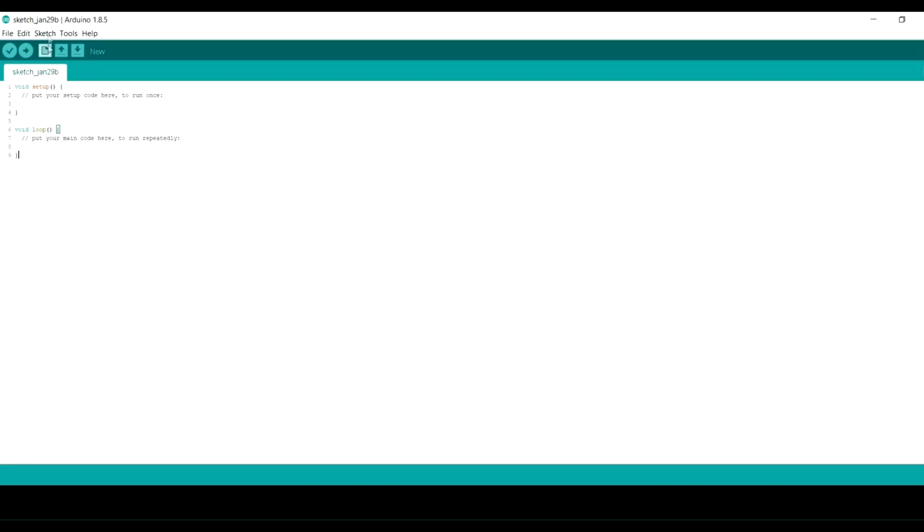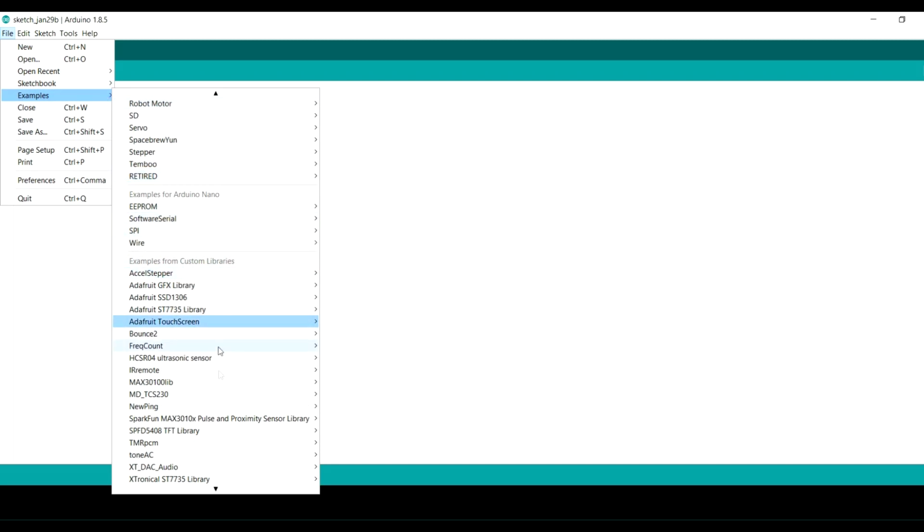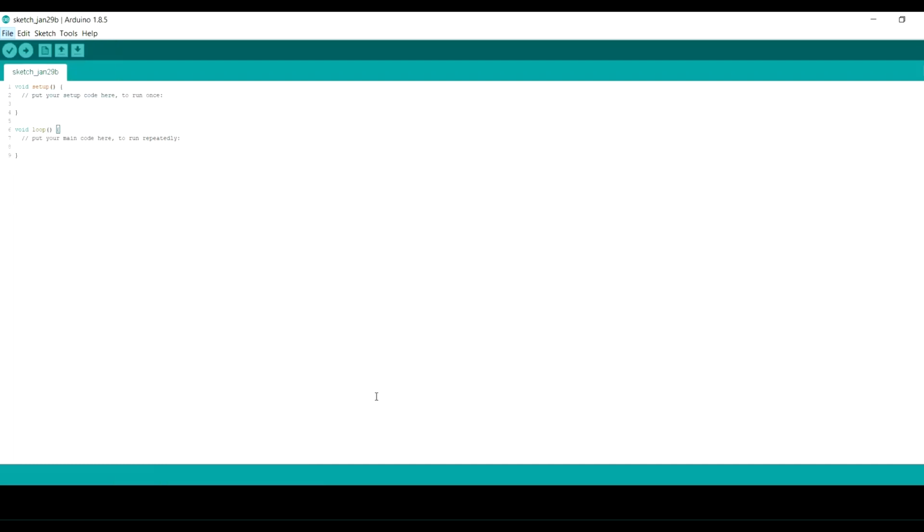So you go to Sketch, File and Examples, and go down here and it's somewhere, I've just gone past it, haven't I? There it is, the 30100 lib. And the one I've found to be the easiest to use is this one, it says underscore minimal. Select that.